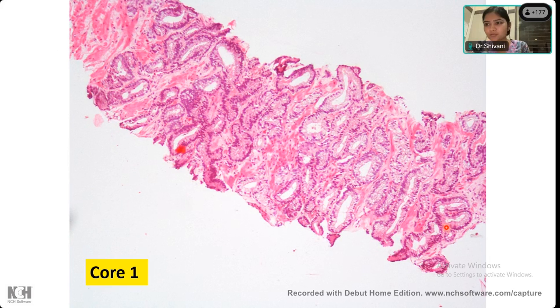No, sir, not stellate. They are rigid, but they are a little longer, longish looking glands. They are cut in a different plane. They may not look very rounded. Understand? You see, this is looking rounded, this is looking rounded, rigid, but they are very closely packed together.